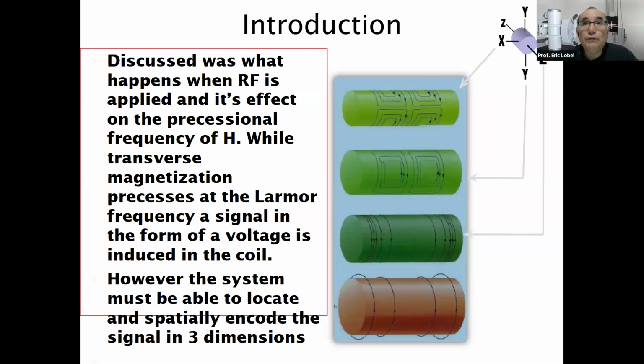And what they will do is alter that magnetic field in a certain direction, right, which is why we have three of them surrounding the patient. They have fancy names that I like to joke about. One is known as the X, the Y, and the Z, and they're spaced out in those same coordinates of the patient.